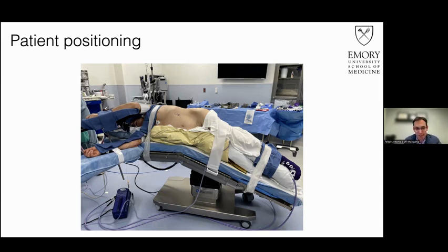We have a full lateral decubitus, both for right and left adrenalectomies. As you can see, the bed is flexed. We have the subcostal margin on the crack of the bed to expose the angle between the costal region and the iliac crest. So you want to open that space because that's where the trocars will be. As for a standard lateral decubitus patient, they're secured with a beanbag, safety straps, and the pressure points are padded.